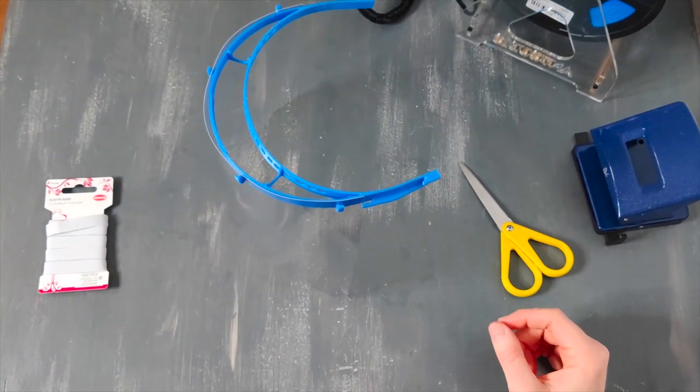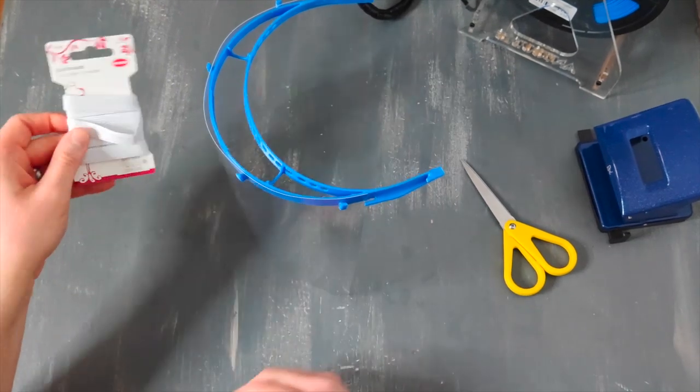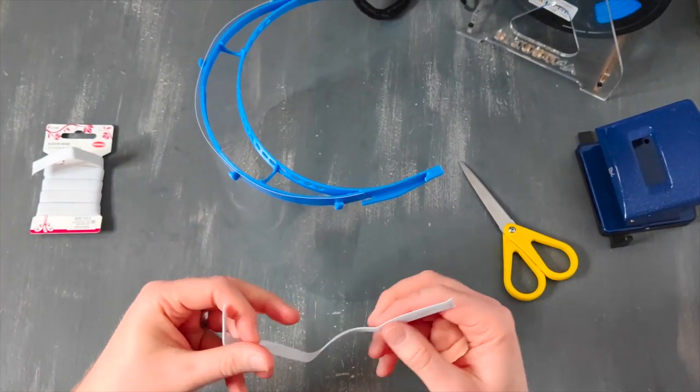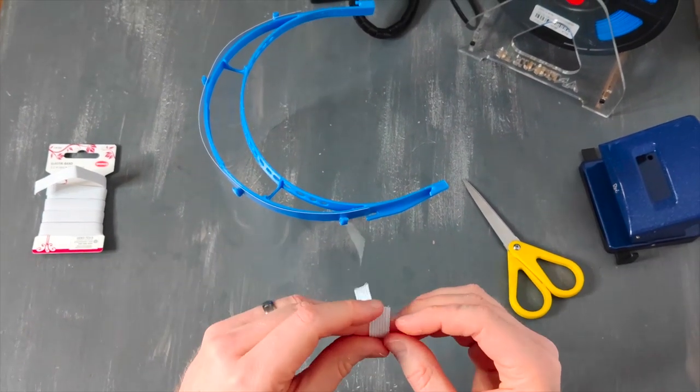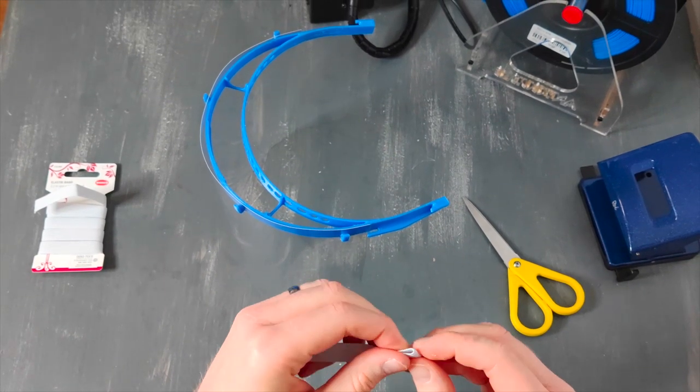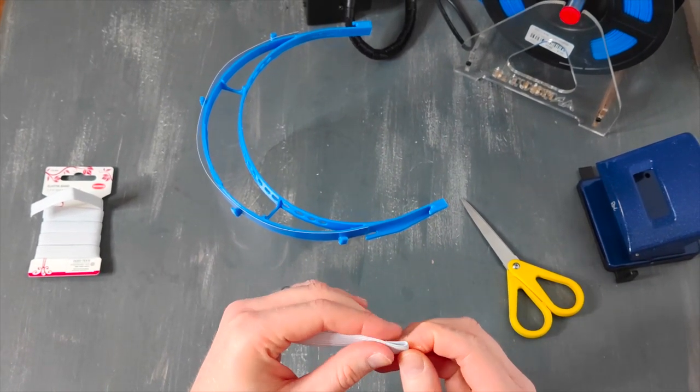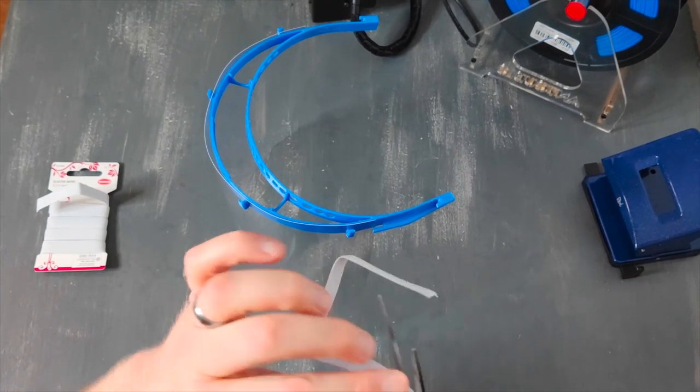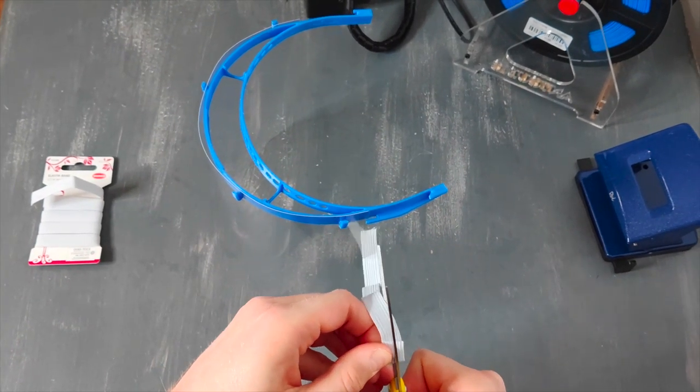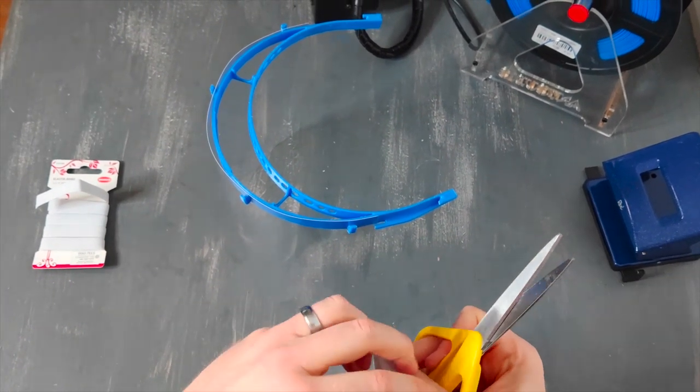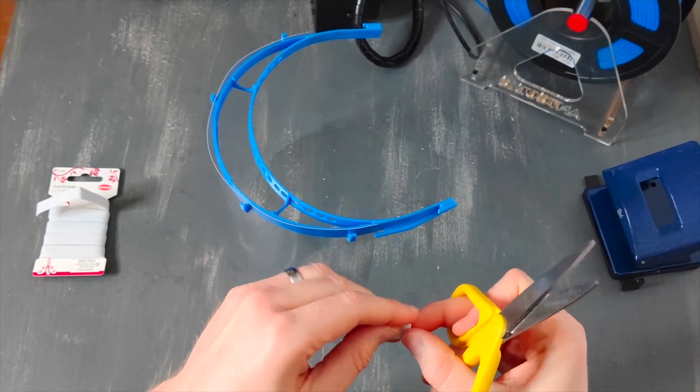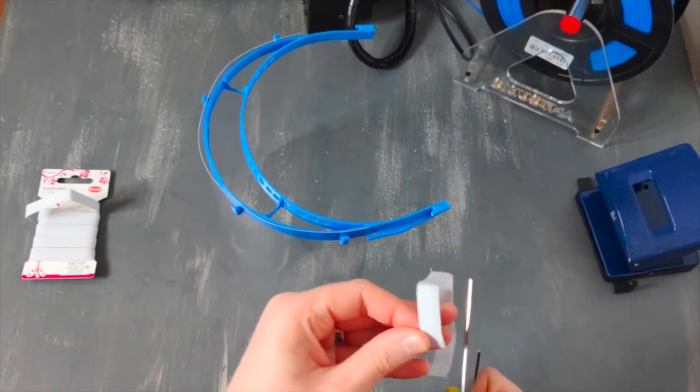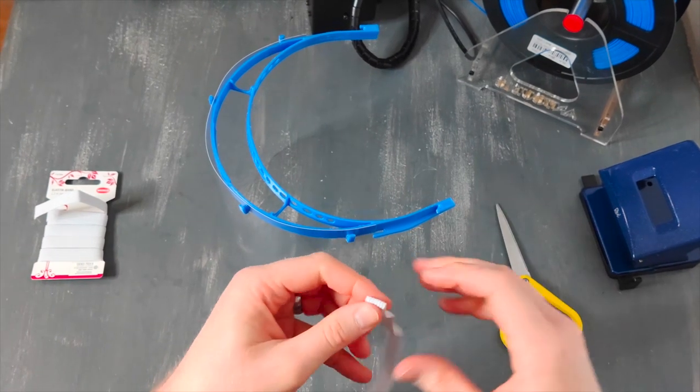Then what we do, we take the elastics. I've already prepared one part here. I just grabbed it at a grocery store. We just round it in a little bit. Take some scissors, put them in the middle. Cut it in, just a little bit, not too much. You do the same procedure on the other side. Just cut it in a little bit.